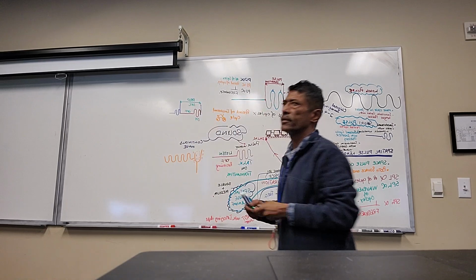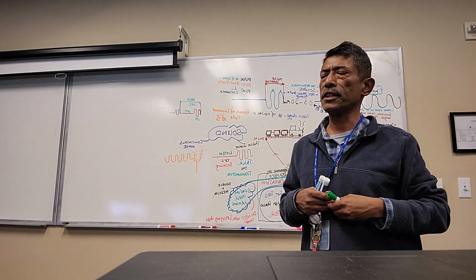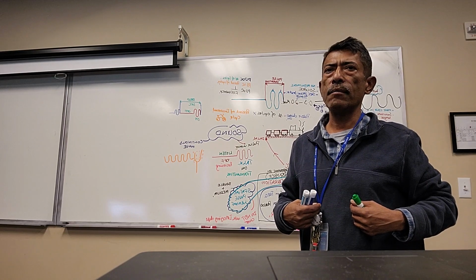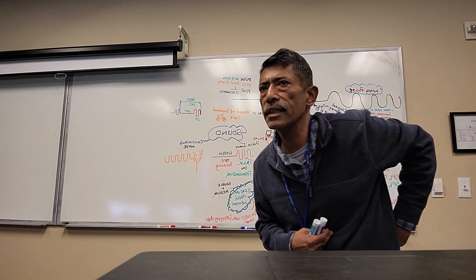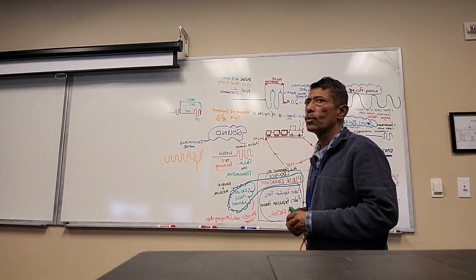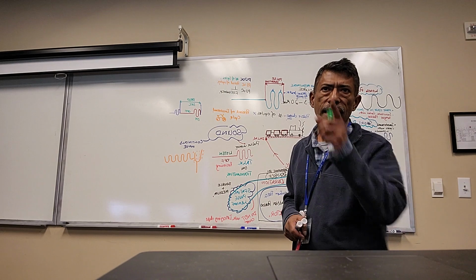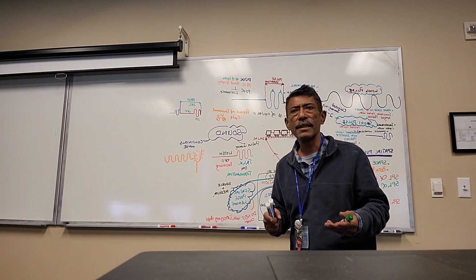So let me ask you this: if I'm imaging the pancreas, which is right here below my xiphisternum, a superficial position, right in the midline, would it take more time to get to the pancreas and come back, or would it take more time to get to the kidneys and come back, which are right here in the posterior abdominal wall? Kidneys. So wouldn't it lengthen my listening time? That's why PRP changes with the imaging depth.